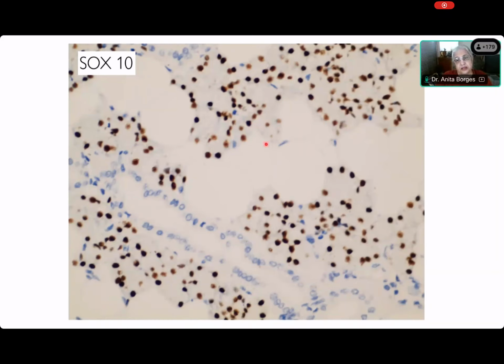They mark, so these are not myoepithelial. So don't believe that SOX10 marks myoepithelial. Yes, it does. It does mark the myoepithelial cells of the intercalated duct and sometimes the basal cells of the striated duct, but they mark acinar cells as well. SOX10 is a peculiar marker.